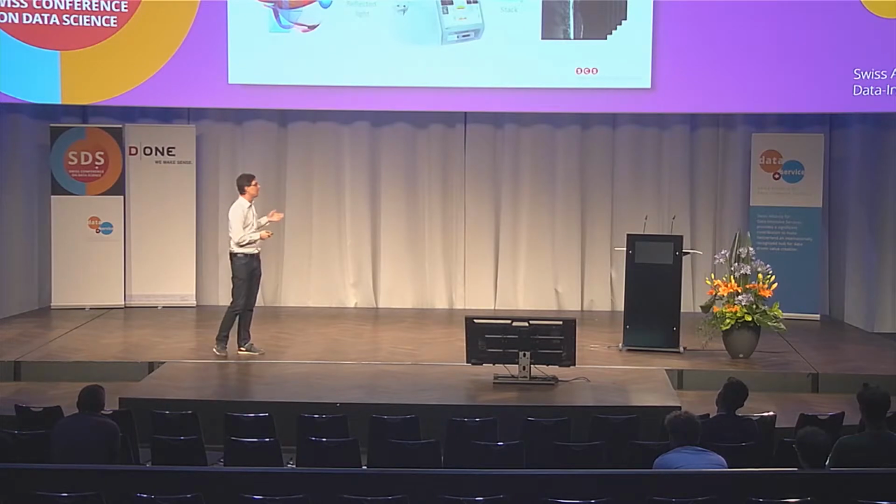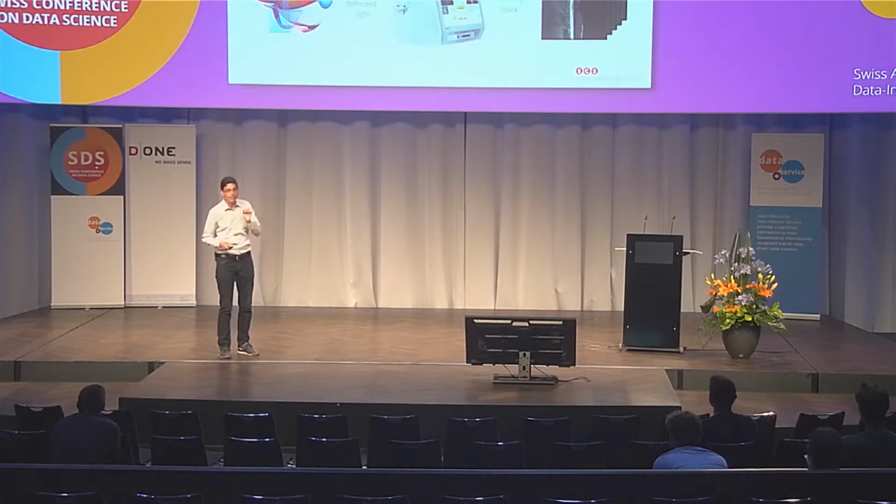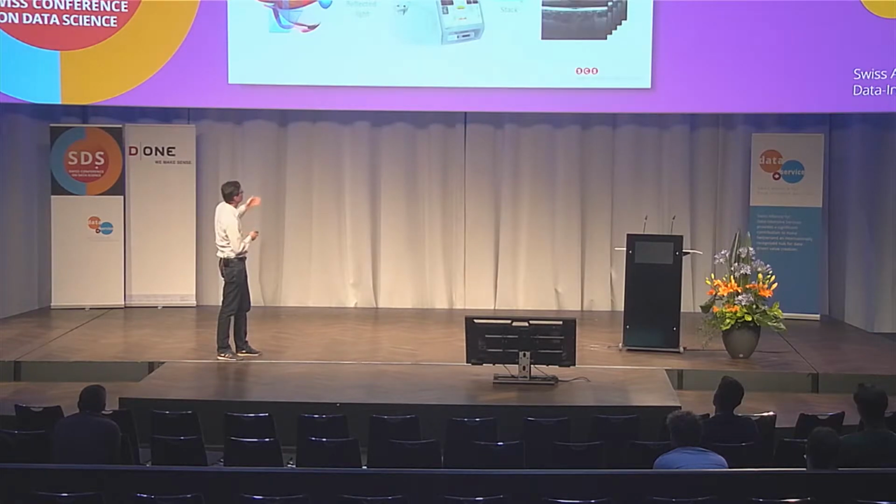And at the back of your eye, there are many interesting structures. The retina is one of them, but also the optical nerve. So if you really have a problem with your eyes, the ophthalmologist usually looks there. He takes those images and looks there whether there is something wrong. Now, when we work with those images, usually we rotate them by 90 degrees, and we look at them in this orientation. This is just for convenience. Somehow the images are easier to look at in this orientation.